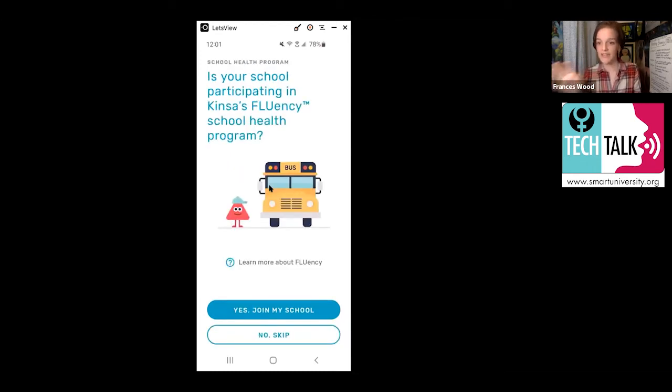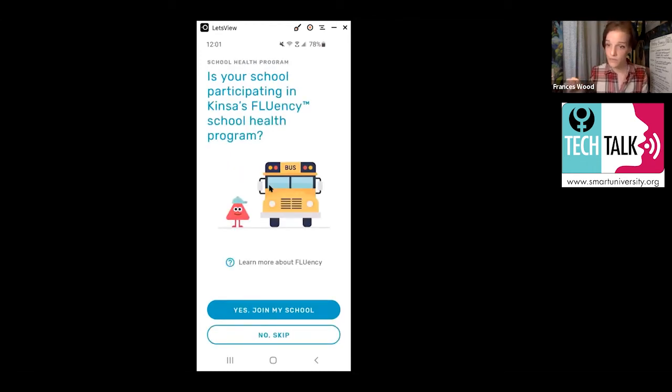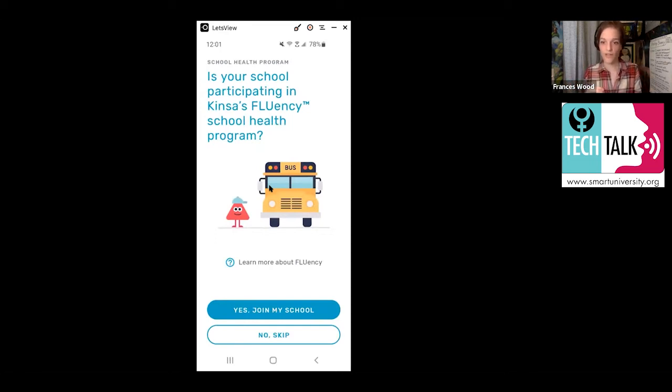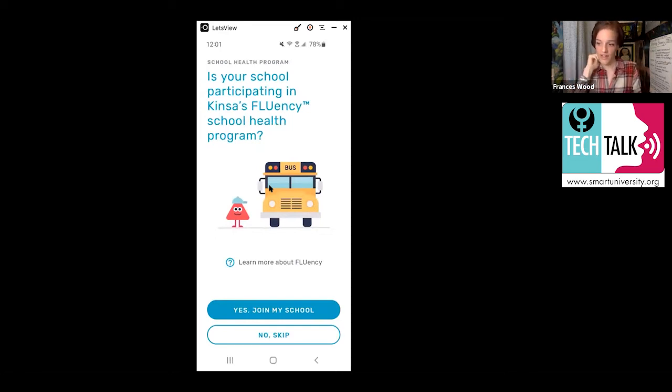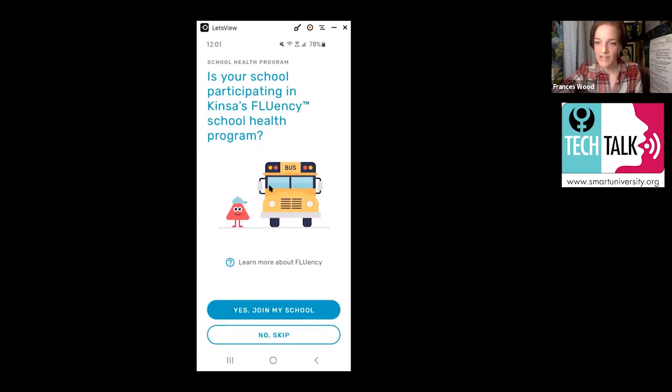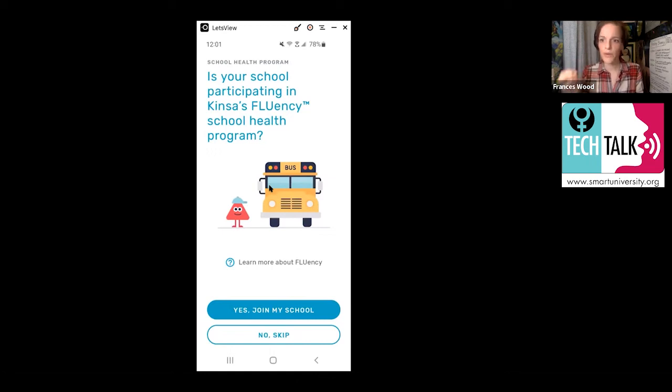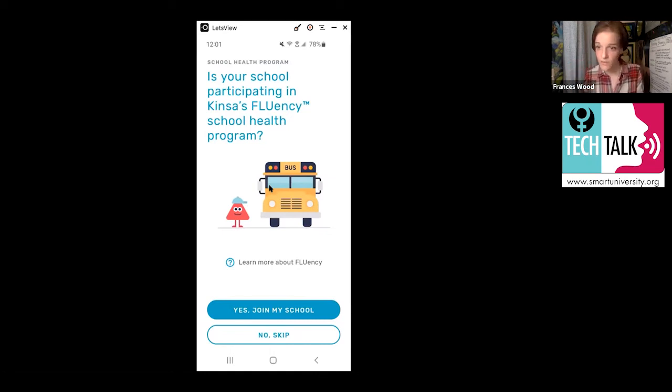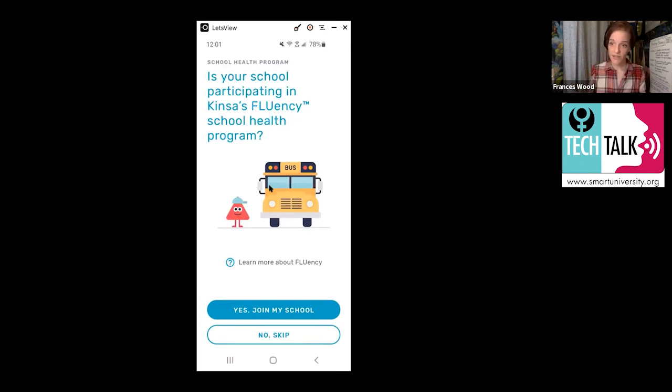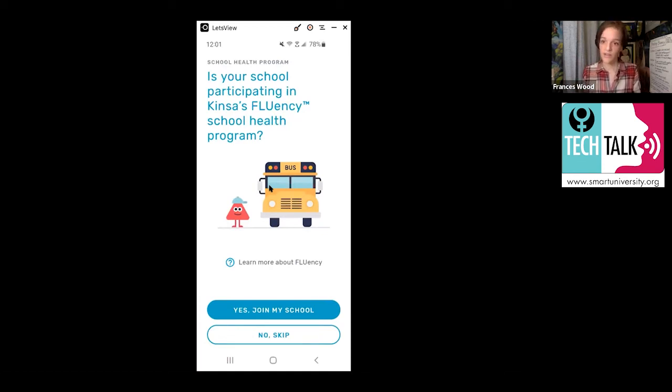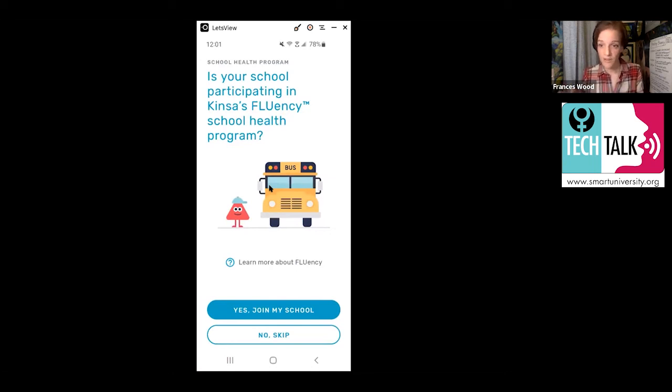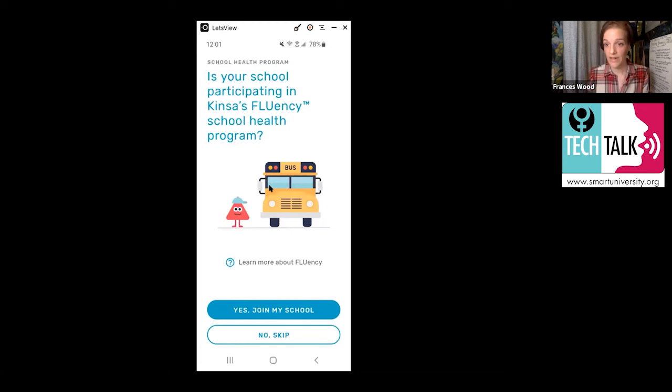And then this is an extra step. There are some schools that actually have their own school group so that they can trace the likelihood of people or the number of people who have the flu or are sick in a school community. If you have a child who's in school and you want to track that, you can say yes, join my school and it'll give you an option to look it up. Not all schools in New York are attached to this, so it may or may not be on there.